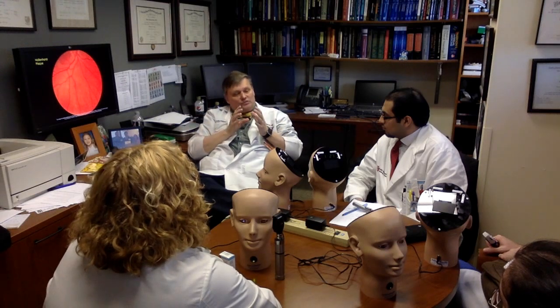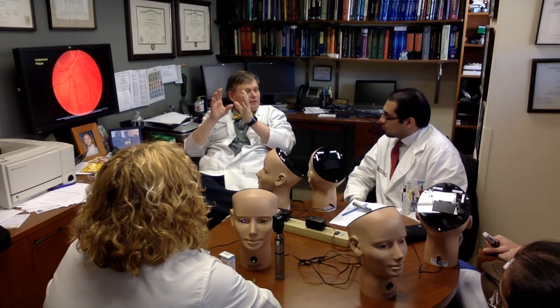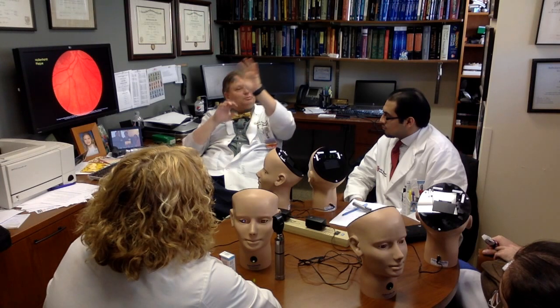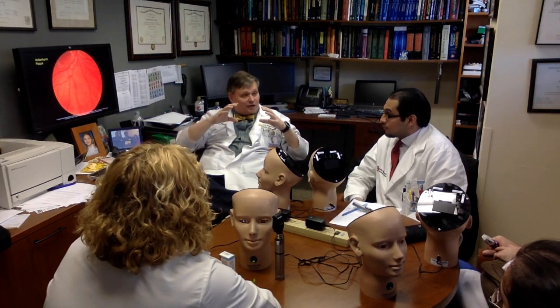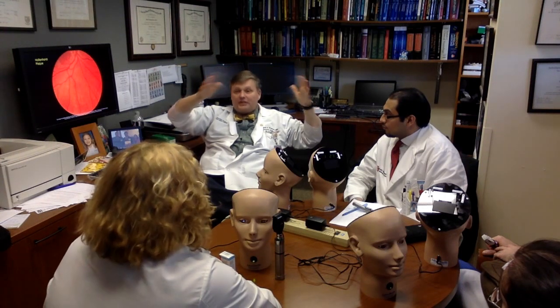And the goal is very simple. The goal is, can I see the disc? Is it sharp? Is it elevated? Can I see the cup? How big is it? All right. Can I see the blood vessels? Any major problem? Cotton wool spots, hemorrhages, things like that. A gigantic toxo scar, a gigantic blue-gray blob, okay? That's what you want to do.